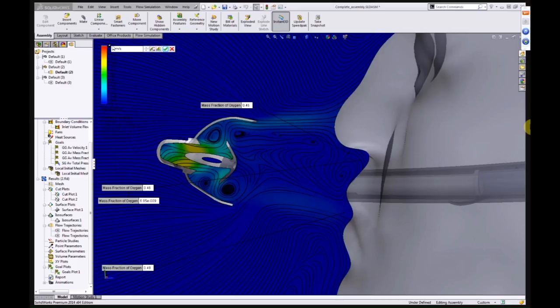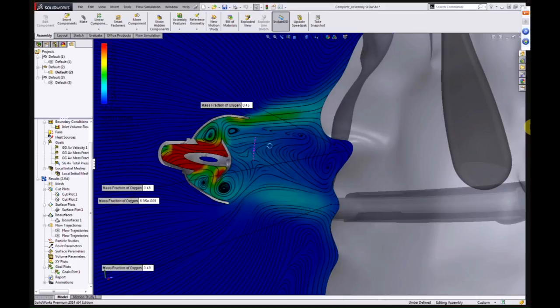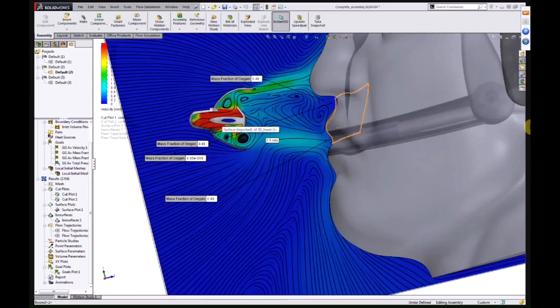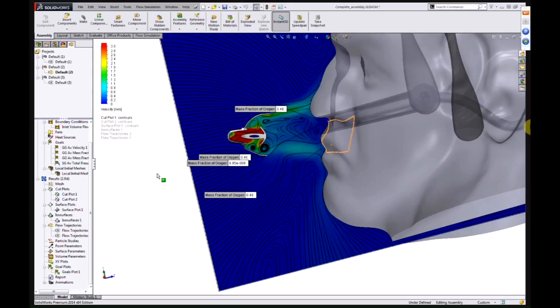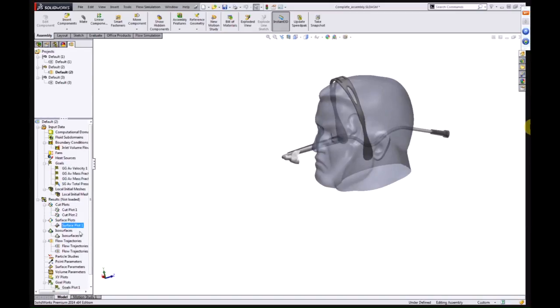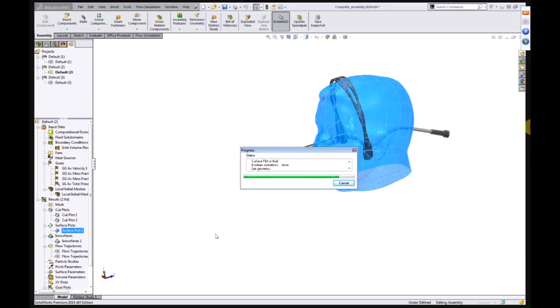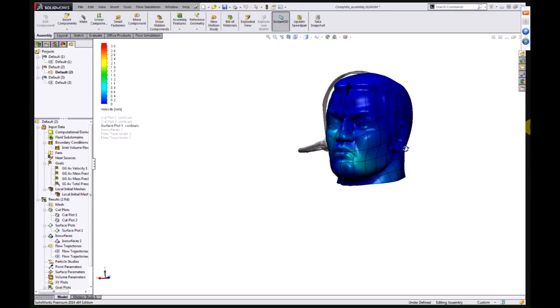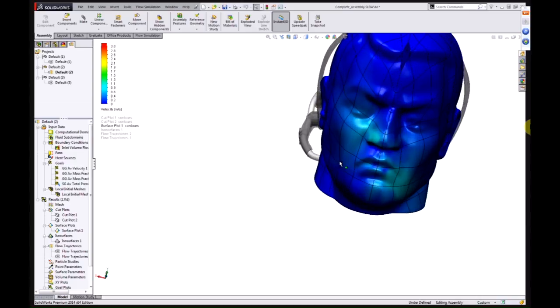And we've got really rich control here. Let's bring these results in. We can overlay things like the oxygen concentration seen by different portions of this patient's face. Because the flow is coming in from the side and it has a very sharp turn, it's non-symmetric, right? And that could potentially be an issue. Actually, that's velocity. We can go look at oxygen concentration as well. Still non-symmetric. We are striking the nose and mouth pretty well.